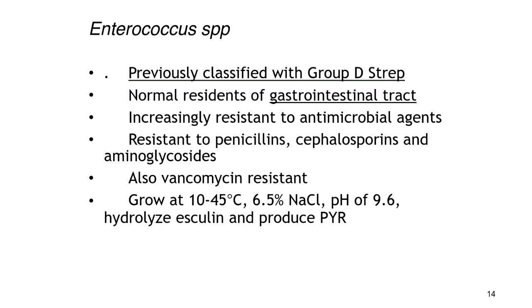They may like a little higher sodium chloride, a pH of about 9.6, and they produce PYR. So a lot of these would be tests, the esculin hydrolysis, esculin and producing PYR tests, probably more so only in a bigger diagnostic lab.